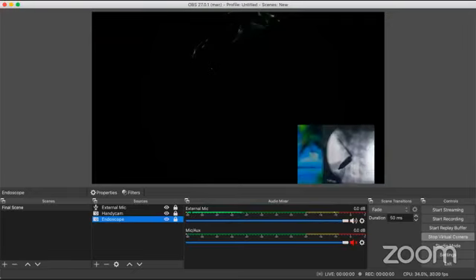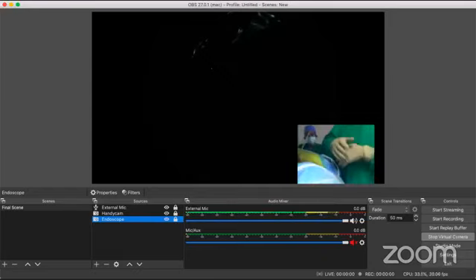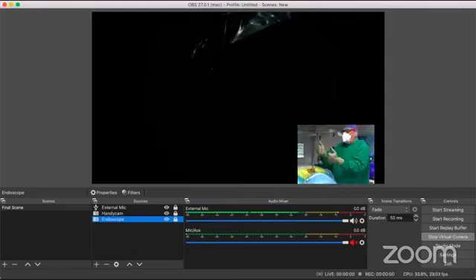Take the C-arm back. One is now I'm sure where I am. I don't need the C-arm. Bring the camera trolley in front. And it has established my angle of working. Now I know at which angle I'm going to work. So this was very important for me.